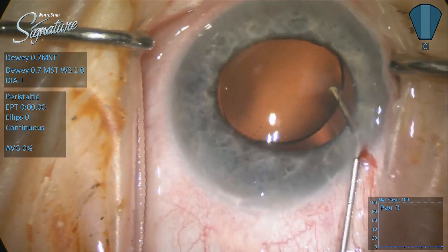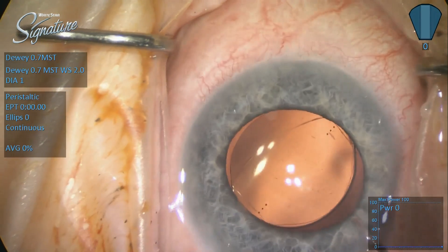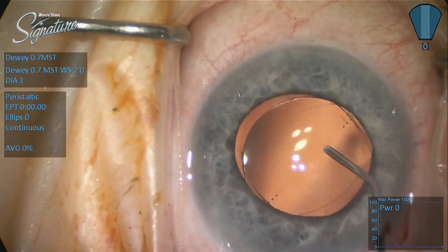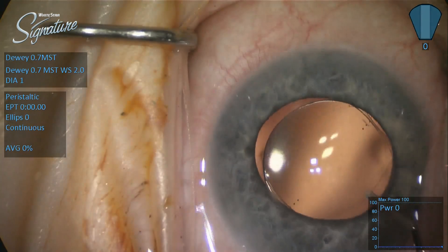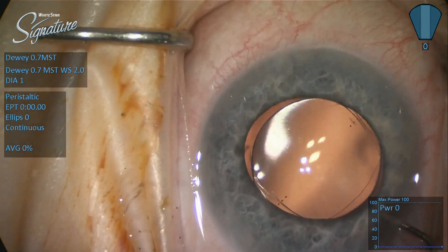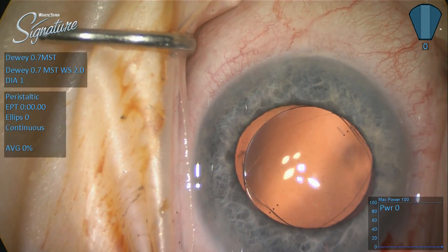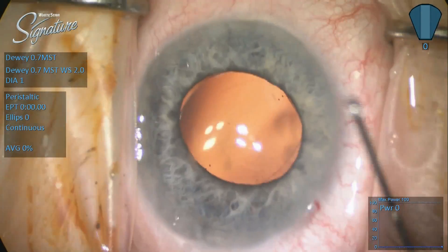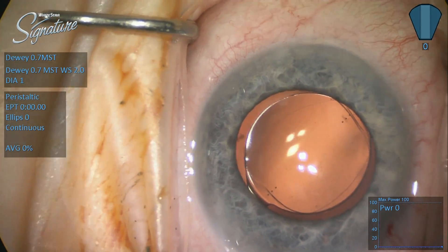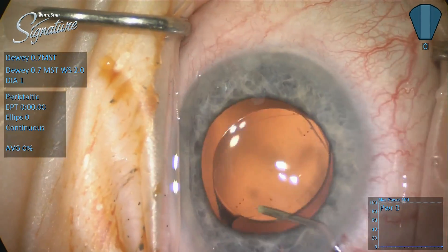So in this case, we're going to irrigate the viscoelastic out from the posterior capsule, making sure we really don't end up with capsular distention syndrome afterwards. We don't want to leave any viscoelastic in the anterior chamber either. I'm trying at this point to center the lens so that the toric alignment marks are perfectly aligned with the corneal alignment marks created by the Catalyst, and also that we've got really good even capture of the optic. We want about the same amount of capsule under the optic on both sides, and we don't want to induce a tilt situation in the eye.